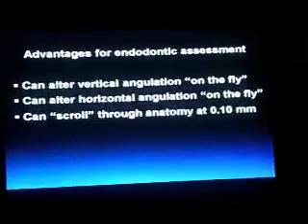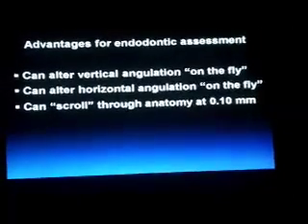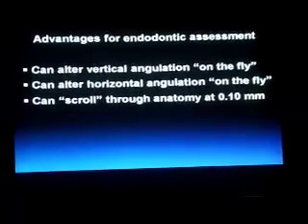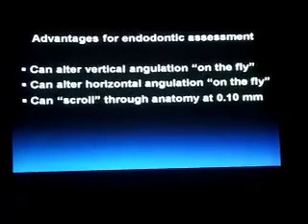One thing that I think is beautiful for a general dentist doing endodontic procedures, or for an endodontist, is to be able to change in the software programs — the one that I use in particular — the vertical and horizontal angulation on the fly as you go. You've all taken an off-angled periapical radiograph to see that other root or those other canals. You don't have to do that. You can get the CBCT data, a small volume data set, and then there are little scroll controls that let you adjust it horizontally and vertically.